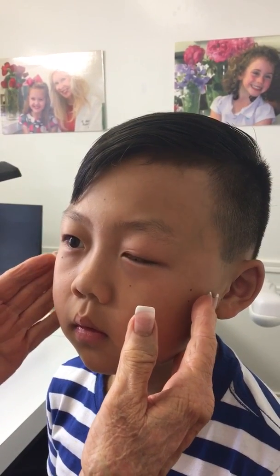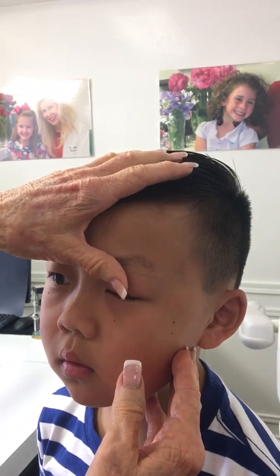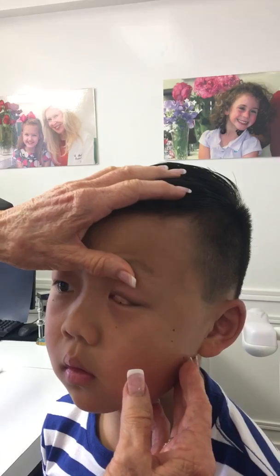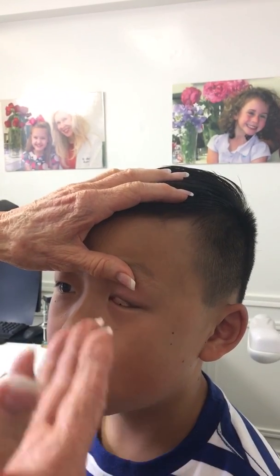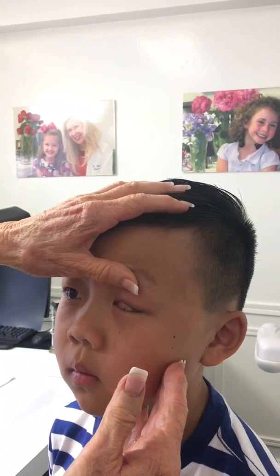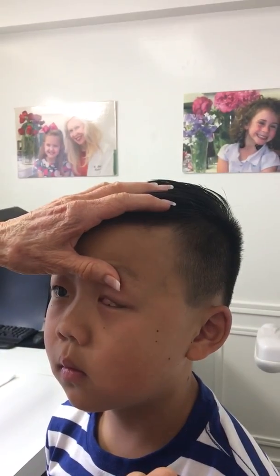So, again, we're starting this morning and we're trying to use stenting therapy to raise a lower lid. This is the first time that a piece has been worn overnight — we've been in acrylic, we've been in glass — and so successfully he has worn the stent overnight. You can see that we are getting the lid repositioned for beautiful, normal anatomy. Once the anatomy is in place, the physiology, which is tear film, follows.